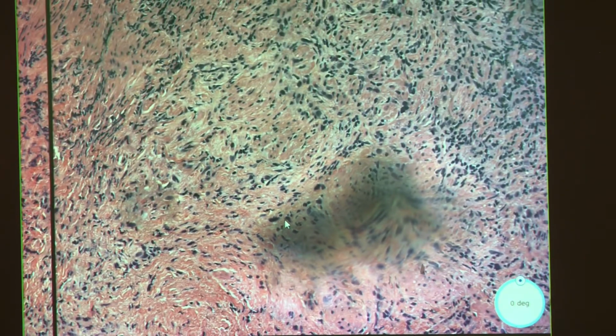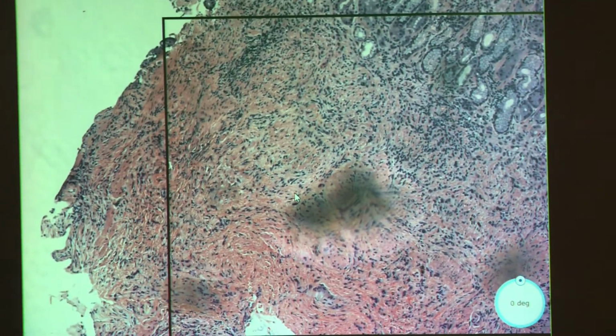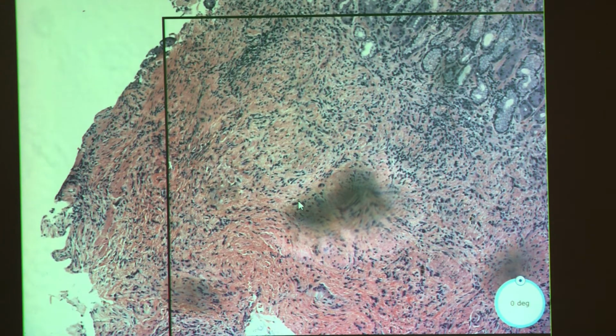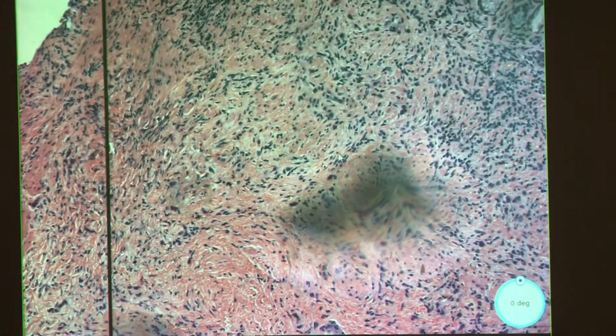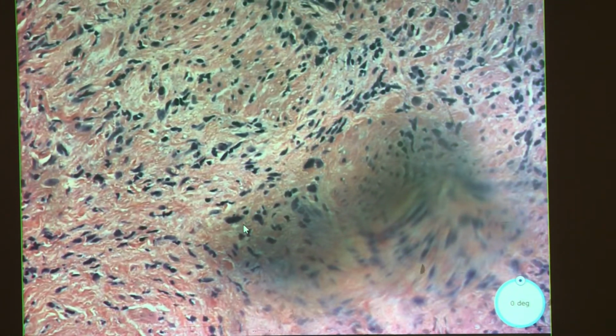I was like, let's put a pin here, because this is where I would be looking. It's way too cellular for a normal stroma, I feel, and these cells do stand out quite strongly, but they're not really forming anything in particular. They look like just single cell streaming. So this is like a poorly differentiated carcinoma. Love it. Yes. Okay.